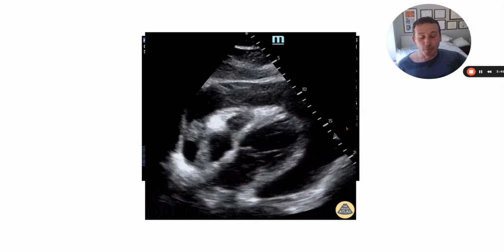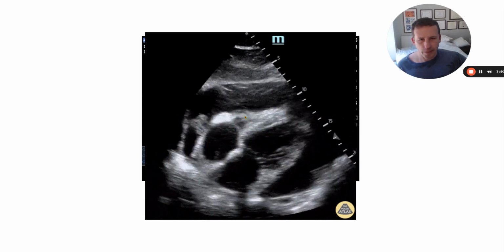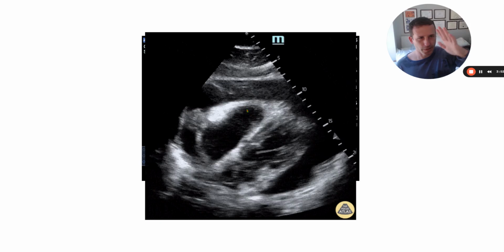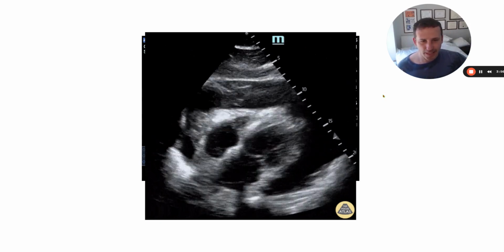Here's an example of an even bigger effusion, and you're seeing some tamponade physiology too. So if you keep an eye on that RV free wall, it's almost like it's doing this thing. So not great. That should be drained.